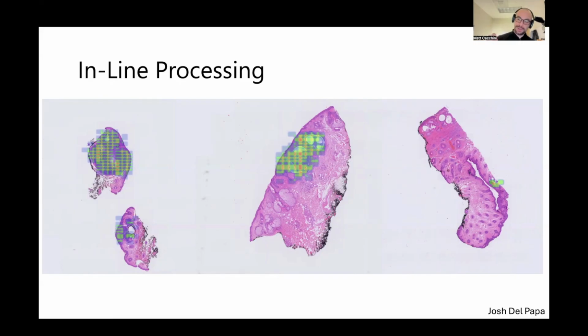Whereas this, if it just brings your attention there, it can really help and increase your efficiency for doing these things. And then it also shows to the surgeon as well, like, oh yeah, it's positive, but it's just a little bit here on this one side, versus these that have large elements of tumor on them. And this can help drive their decision-making process as well. And because you're running on a scanner, they can see it in real time, which is actually quite a cool aspect of doing this. It's not something you need to send to the cloud. This runs directly on the scanner, utilizes the edge compute and the kind of empty GPU space on the scanner, which I think is a huge unlock that we'll see more and more of.